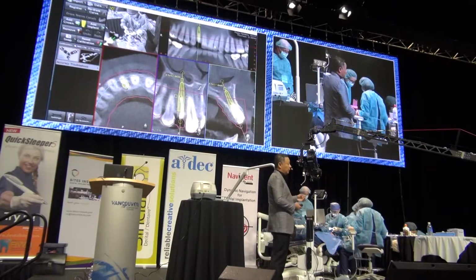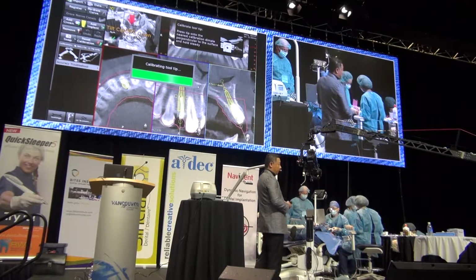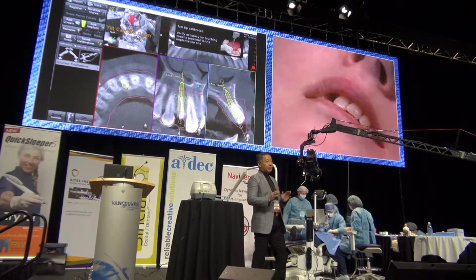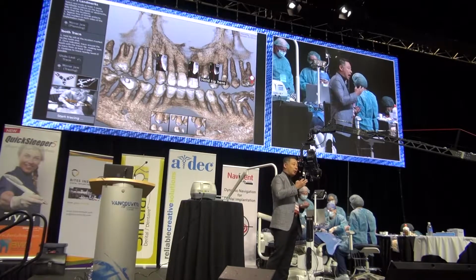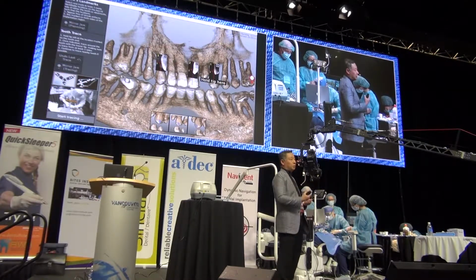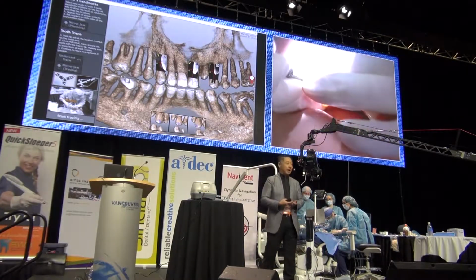As you can see here, we have the mapping of the osteotomy. We do not follow the apex angulation. As you can see on this design, it's going to be palatal to it and apical to it. For immediate anterior protocols, that's what is mandatory. So you have to make sure the patient has the available anatomy for that.